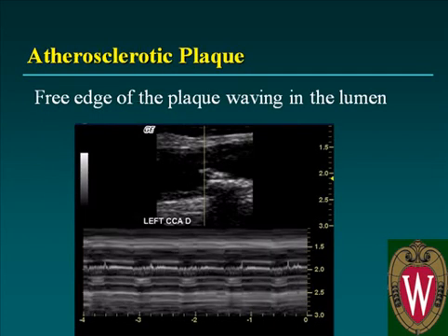This is an example of a free edge of atherosclerotic plaque that is waving within the lumen, and we've done an M mode showing the motion of that free edge here.